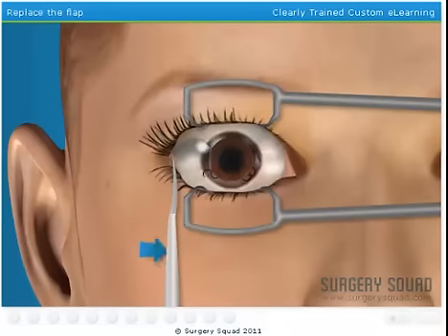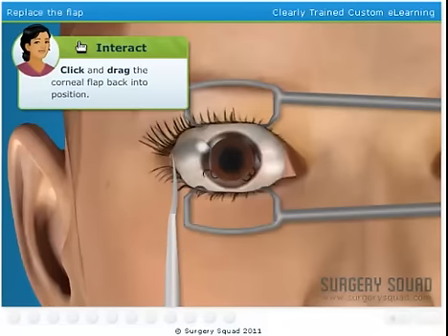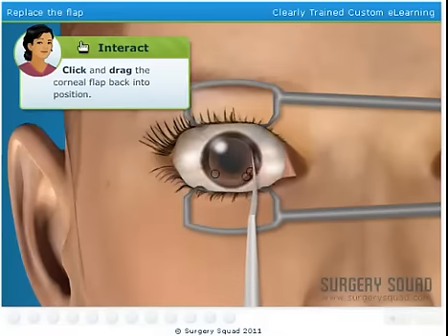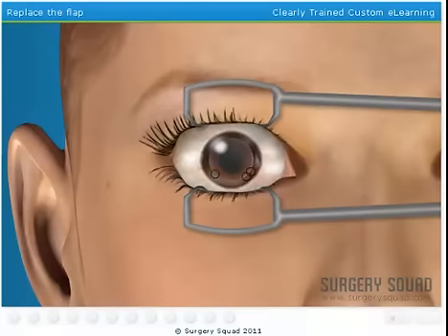Please fold the corneal flap back into the original position, making sure our ink guides match up. Nicely done. While you were working, I went ahead and took care of the other eye. We will observe our patient for several minutes to assure the corneas bond correctly. The cornea is quite amazing in this respect — it will be bonded back to each eye in moments.